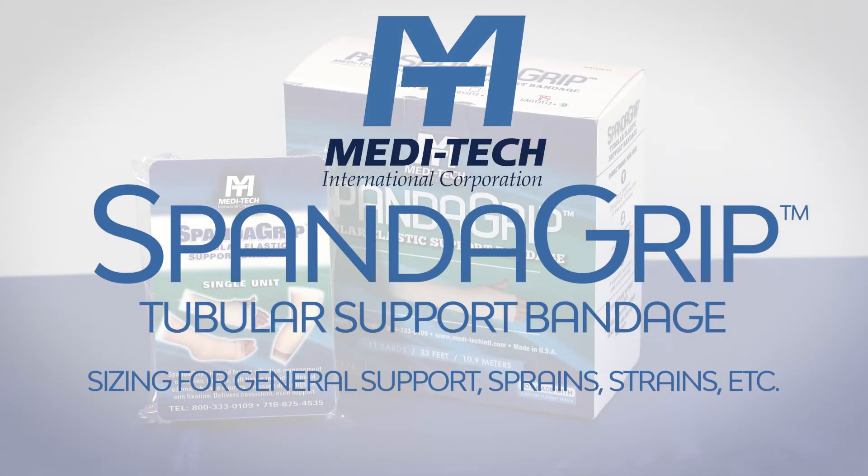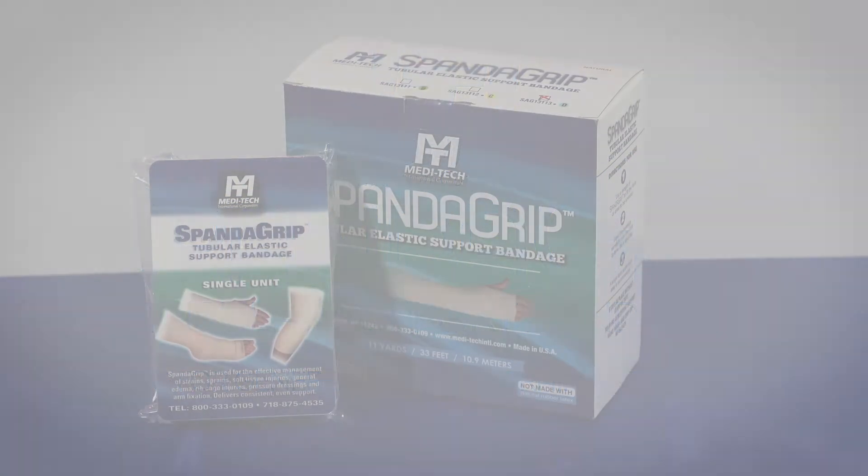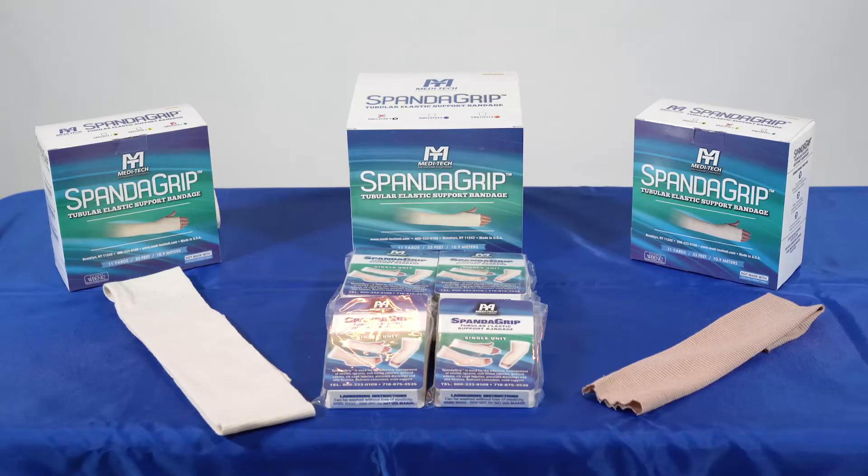Sizing for the proper fit of SpandaGrip for general support applications — sprains, strains, etc. This video will give you guidelines, but the final sizing decision is always up to clinical protocol in conjunction with patient input.